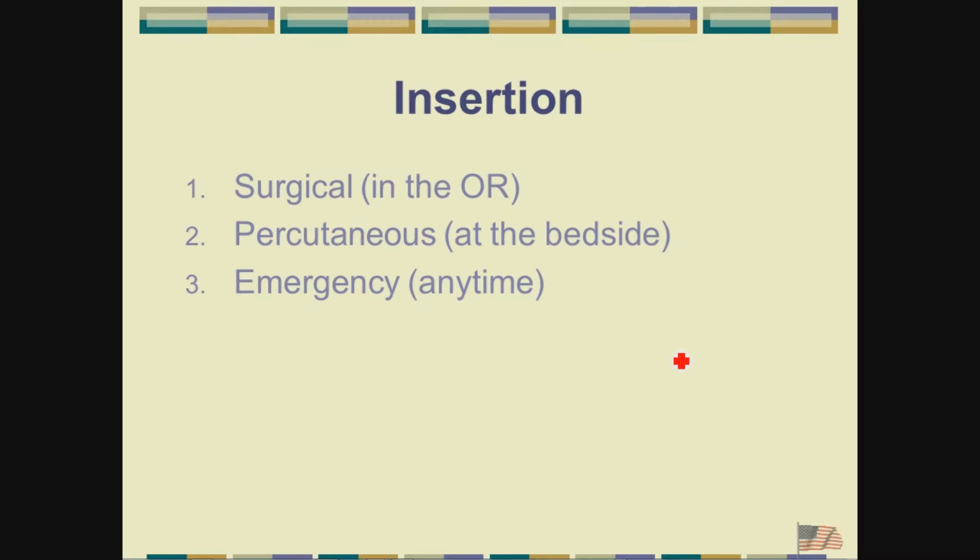But it is getting better because they use fewer dilators. And the tube is structurally a little bit different, but for the most part, it's the same kind of tracheostomy tube that ends up going in. The good news is that it doesn't tie up an OR suite. That's one of the major reasons they started doing them at the bedside. Also, the pulmonologist and intensivist can bill for the procedure rather than giving it to the surgeon. It's always about who gets the money in the process.